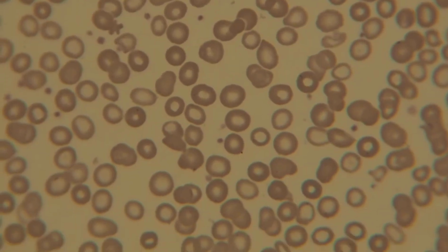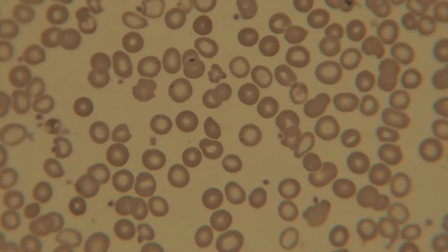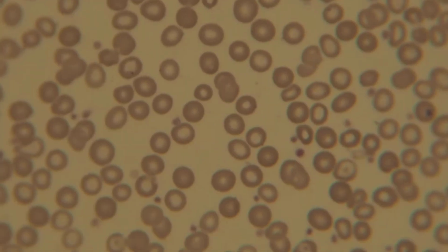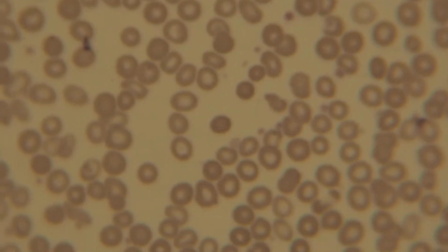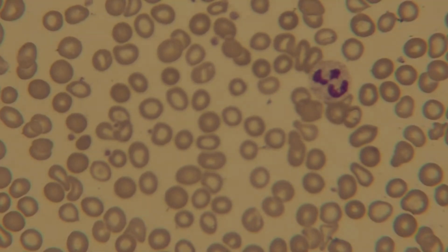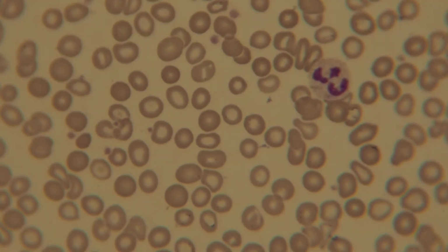I can definitely see some rouleau. Definitely seeing hypochromia. There is definitely great anisocytosis. Neutrophil. I'm seeing some target cells. Let's keep that in mind and see if that impression holds.